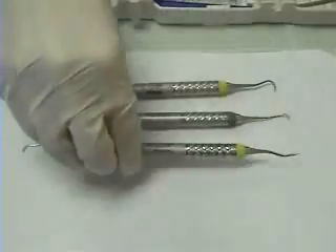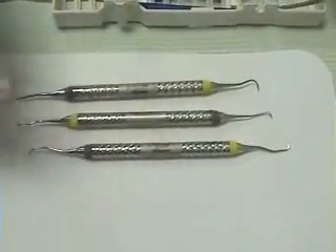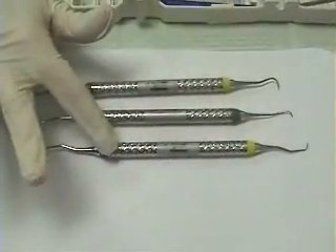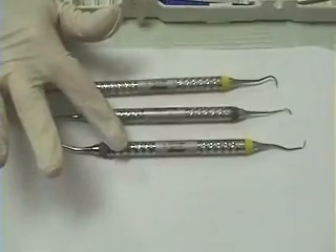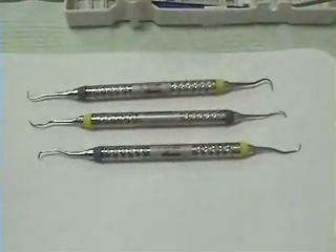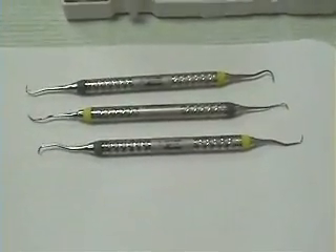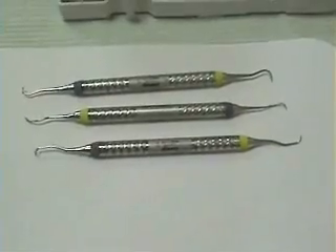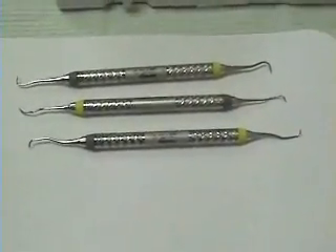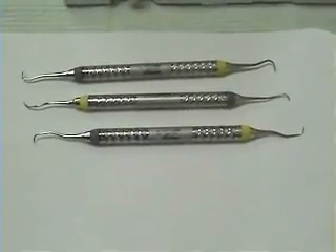The next instrument in your kit is the Gracey 1-2. It has a cutting edge on each end. The ends are balanced and it is used for the anterior teeth. The Gracey series is specifically designed for fine to moderate calculus in deep narrow pockets. Your Gracey curettes are after-five, meaning they're designed for pockets of a depth of five or more, with rigid shanks.